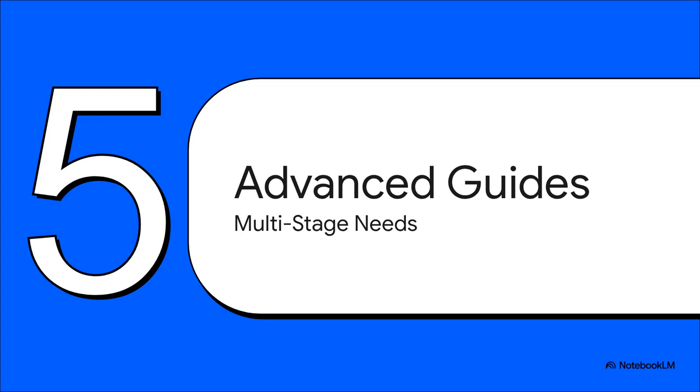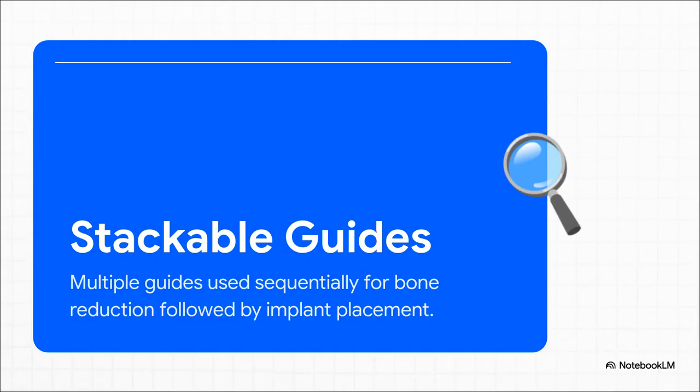Next up, Section 5, Specialized Advanced Guides. Now, what's really interesting about this slide is how we move beyond standard protocols into highly engineered guides built for multi-stage clinical needs. An incredibly ingenious example is stackable guides. Instead of just one guide, this is a whole sequence used during a complex procedure. So the first guide might direct your bone contouring, and then a second guide literally stacks right onto that newly modified anatomy to direct the actual implant drilling. It's just a super smart way to manage complex full arch modifications step by step.